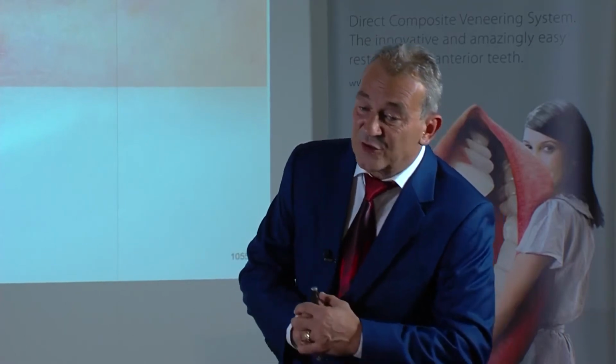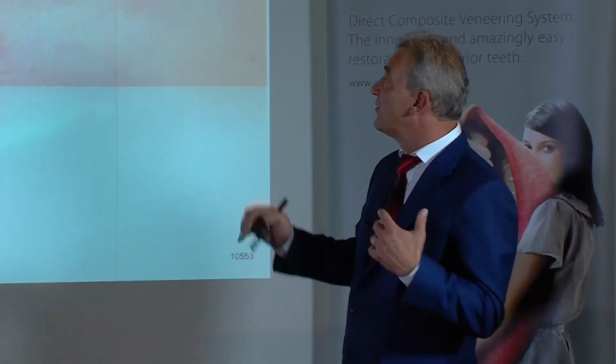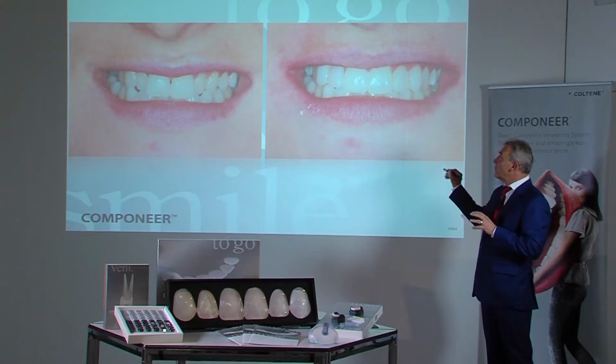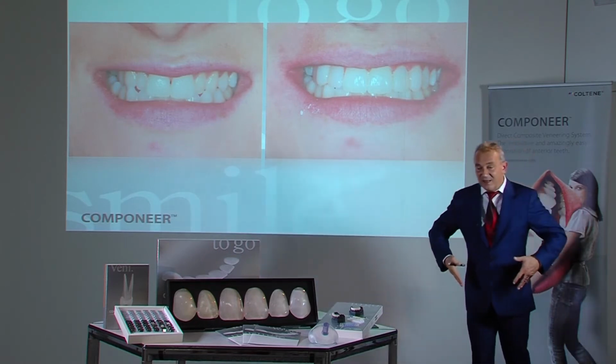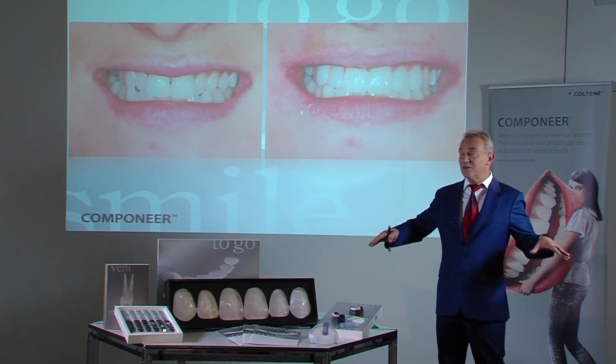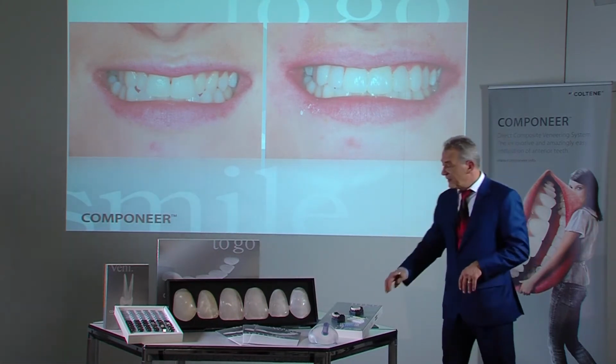Here the diagnosis is very helpful, as it also gives information relating to the aesthetics to be expected for the final outcome. One needs to be aware, in such situations there will be a marginal inclination outwards. The teeth pivot outwards, as otherwise we would not be able to get past the lower teeth.